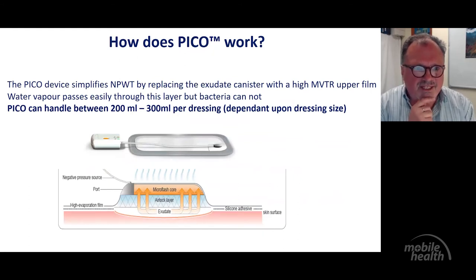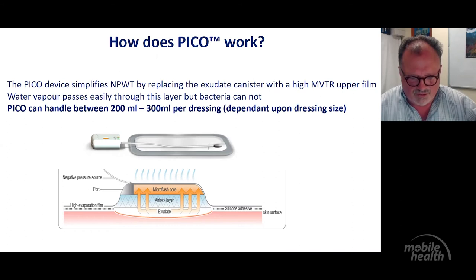So I'm quite flabbergasted by the way they developed those dressings. I love it actually, because the moisture transfer rate of those dressings is enormous. There's an airlock layer in, and those dressings can leave the exudate out, and the water vapor passes through those layers of dressings and evaporates, all right? So only the crystals basically get stuck in the wound itself. Only the hard bits get stuck in the wound.